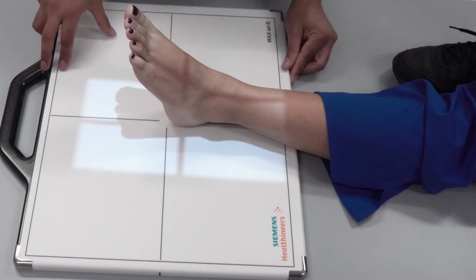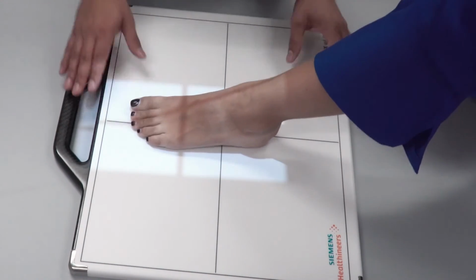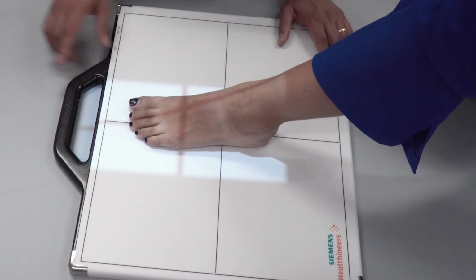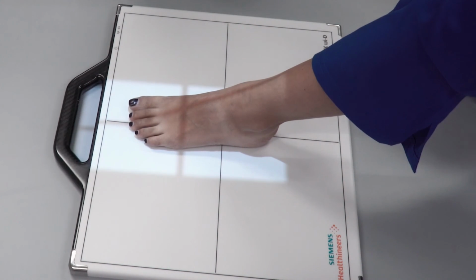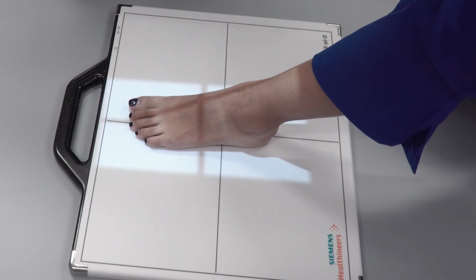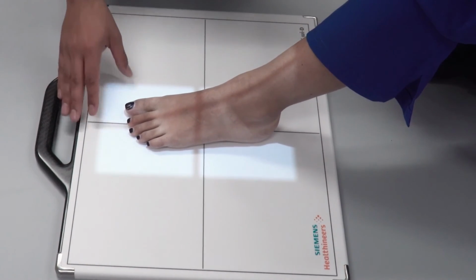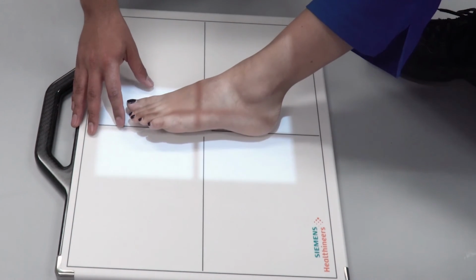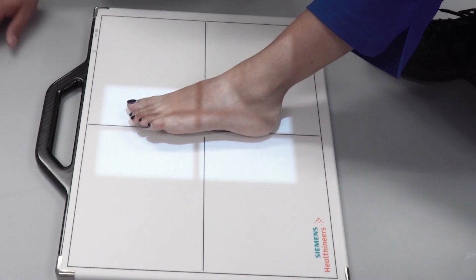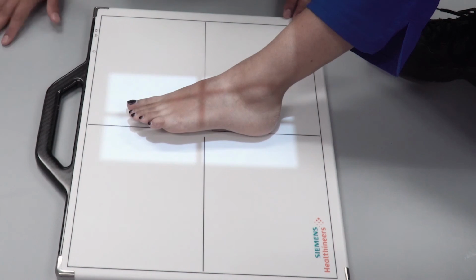Let's take a look at positioning for the feet x-rays, AP, oblique, and a lateral view. In positioning for the feet, we're going to flex the patient's knees until the foot is flat on the detector. You want to center at the mid-foot, and angle of your x-ray tube should be about 10 degrees. And what this does is it opens up the joint spaces of the foot. So going from an AP to an oblique view, want to internally rotate the foot so the plantar surface is 30 degrees off of the detector, and your central ray should be at the mid-foot.